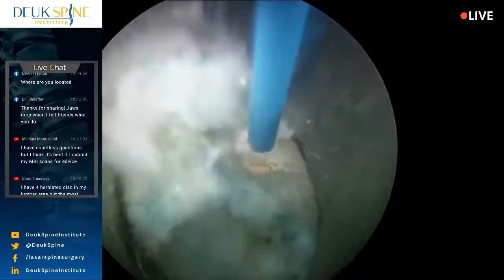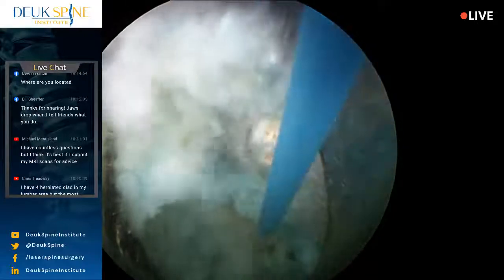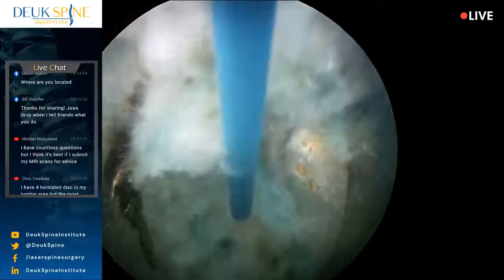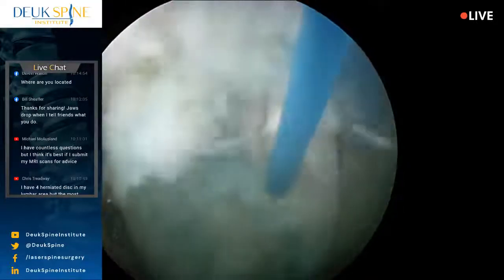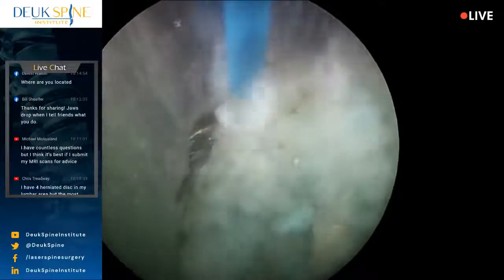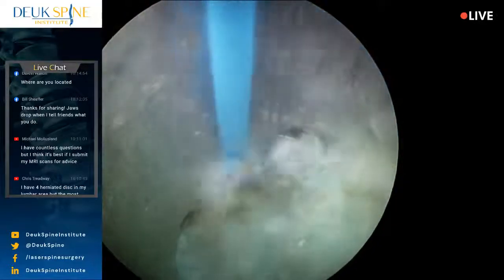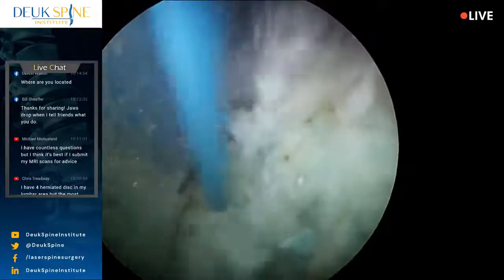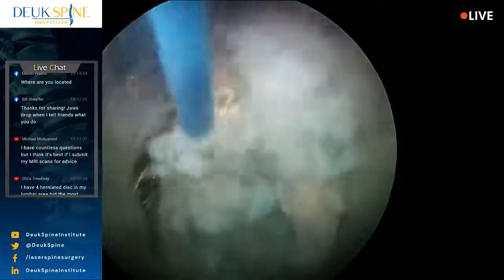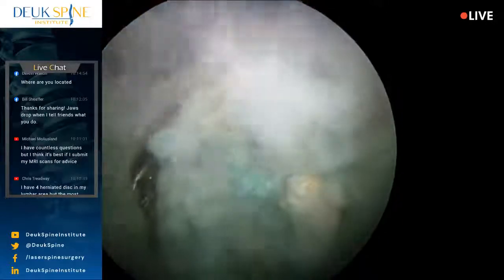All right, so you can see that right there, that smooth surface is the end plate. That's the vertebral end plate. It's the bone on top of the disc, and that is L4, because we're in the L4-5 disc right now. The L5 superior end plate is going to be right over there on the other side. We're not interested in the end plates. I'm not here to fix end plate problems. We don't touch the end plates. Sometimes we bang them up a little. They don't care.